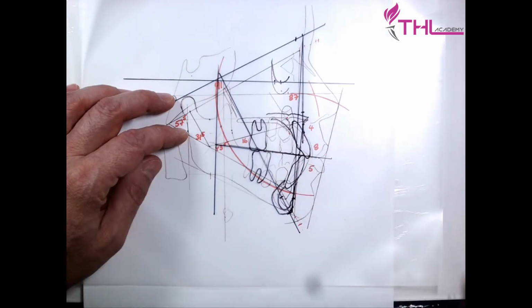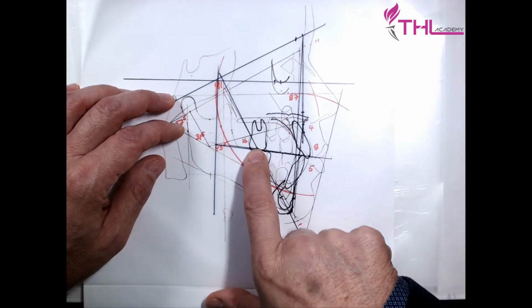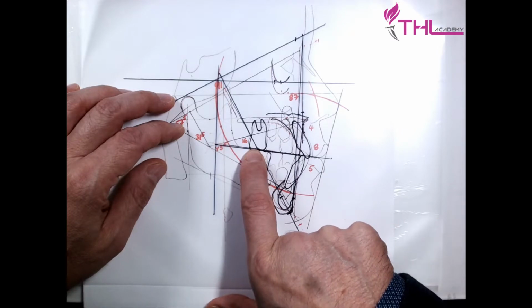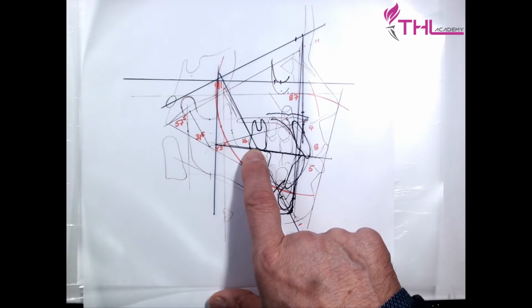Now I can put for visualization. I like to put this in apogonium. And look, the upper incisors are going backward 2 millimeters. And this is the reason I regret in this case not to put any upper anchorage, because look, the plan says that I have to maintain the upper molar, and this is the reason I think the case at the end looks a little bit protrusive.